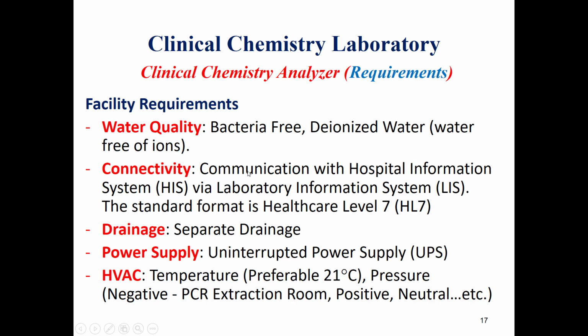Also, we need to provide the connection with the hospital information system via the laboratory information system. The current standard format for the data communication between the analyzers and the hospital information system is HL7. This is the standard format.